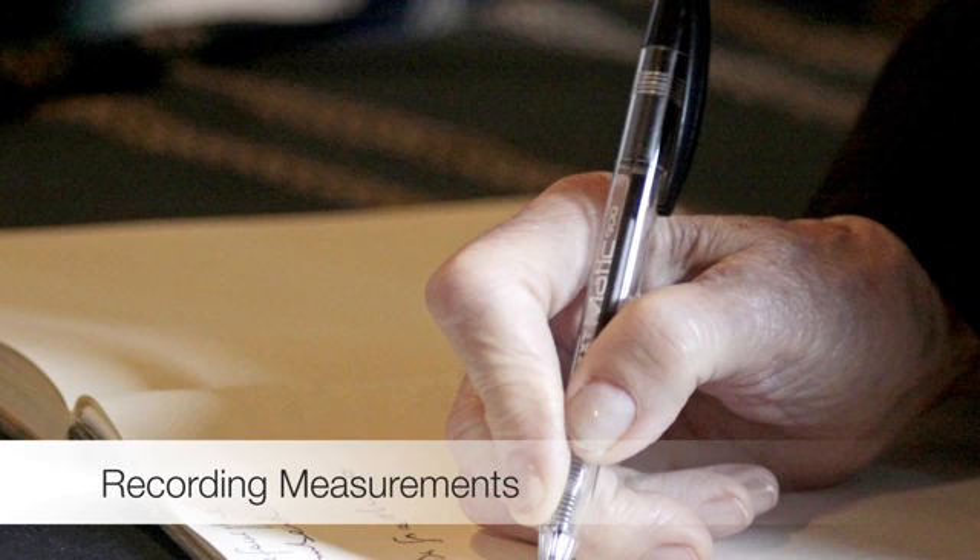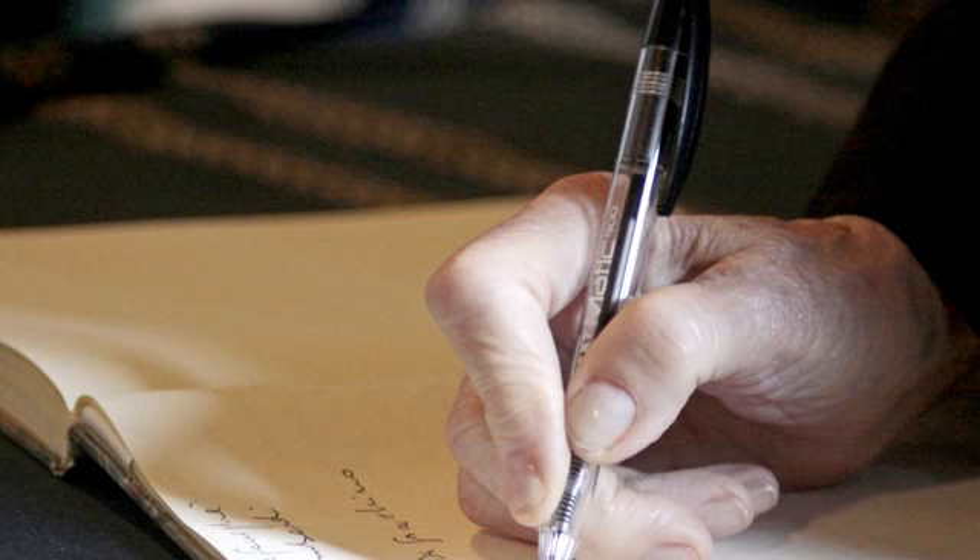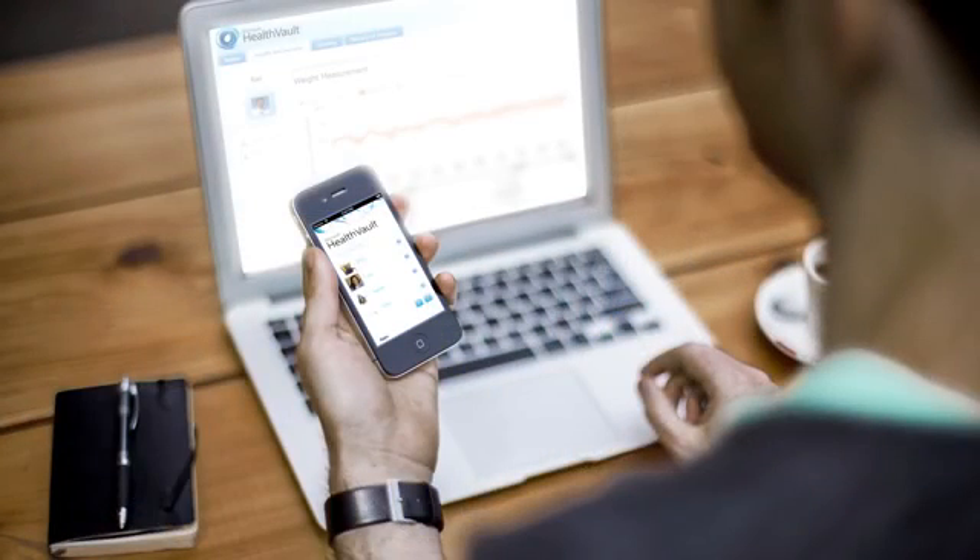You should keep a record so you and your doctor can track your readings over time. This can be done with a booklet included with your monitor or a simple notebook. ADC's advanced models are able to electronically send data to your PC, smartphone, or tablet.